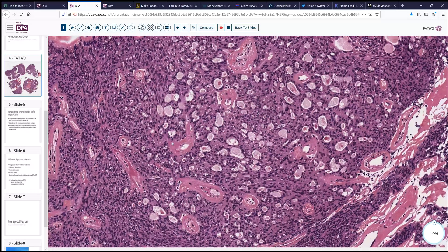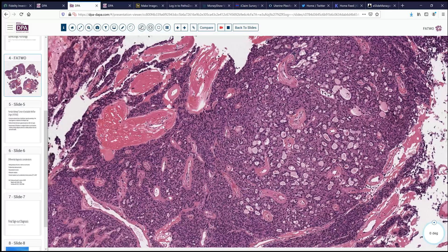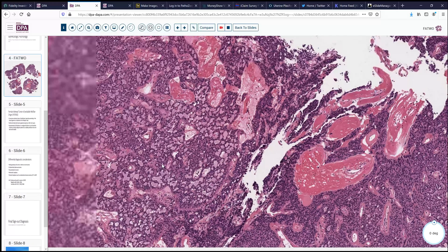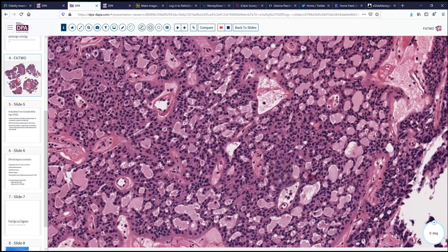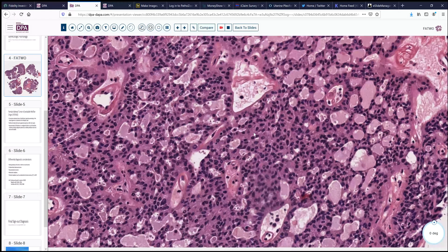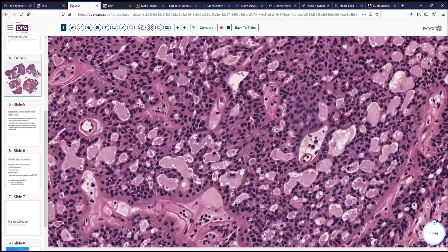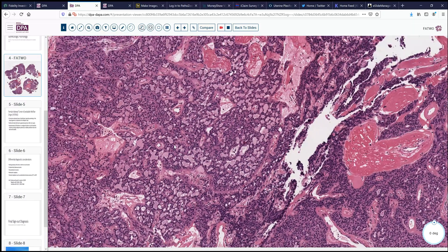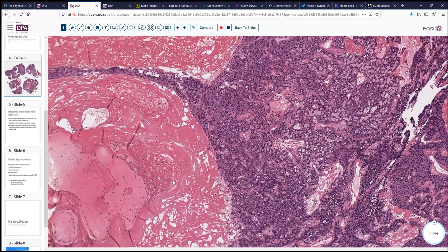We also note there's a lot of hyalinization around the very vascular pattern here, and some of these areas have a very fibrinoid appearance as well. Here's another of these very sieve-like areas — a very delicate pattern, sort of corded and sieve-like, but not high-grade nuclei, not very many mitoses, no single-cell necrosis. This does not look too much like an adenocarcinoma by any means. We'll look at some of the other areas with these very hyalinized vessels and a lot of fibrinoid changes in these cystic areas.